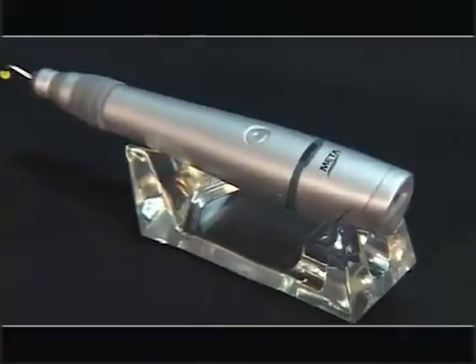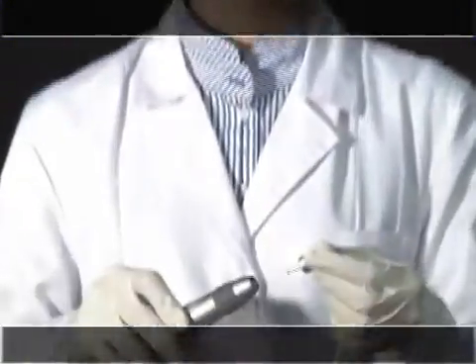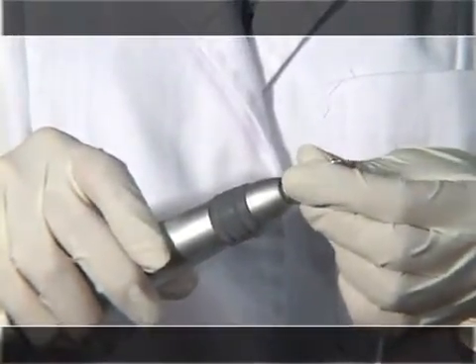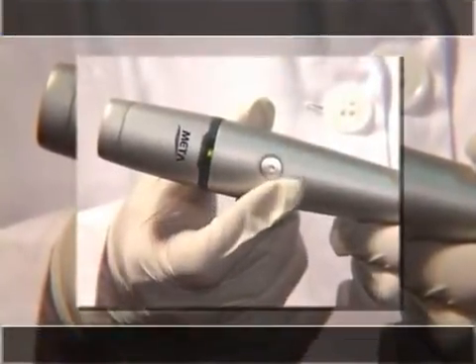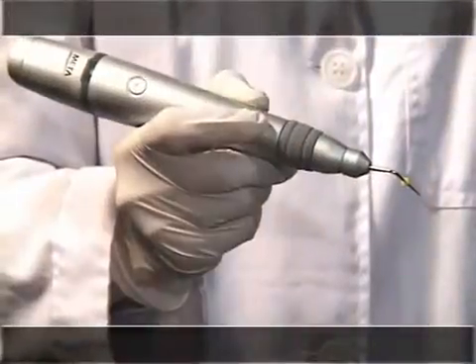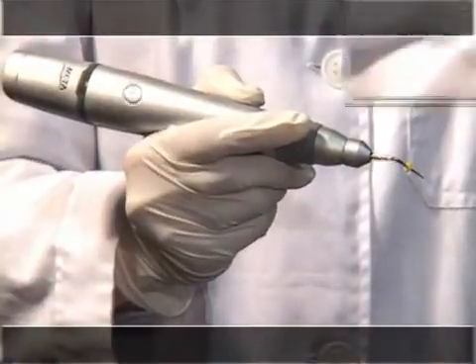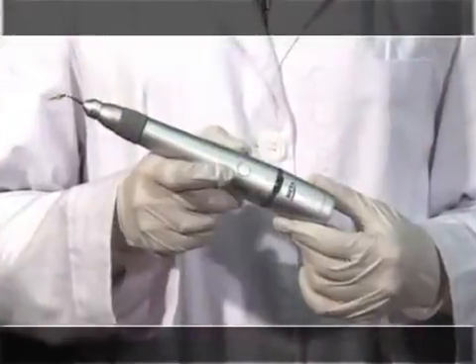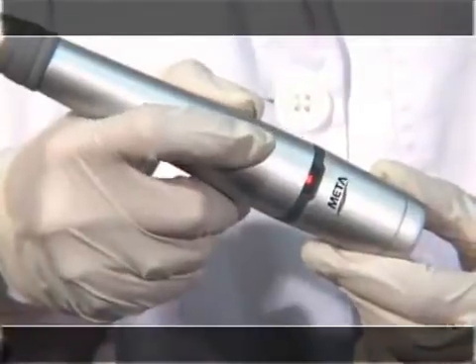This is the method of Master Pen operation. Before using the pen, mount the pen tip into the pen holder. Press the power select switch and select the output proper for the mounted pen tip. Next, press the operation switch. The lamp will flicker with sound as the pen tip heats. After operating, press the power switch longer to turn off.